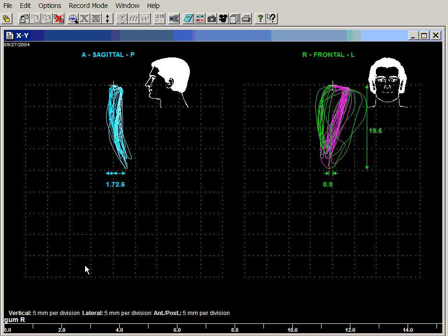This is a subject with a highly worn dentition chewing gum on the right side. We have an XY view where the pink is the closing movement and the green is the opening movement in the frontal plane.